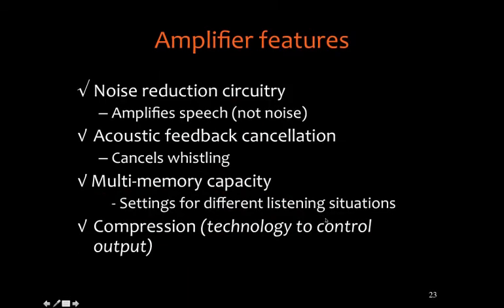In addition, digital processors have a better capacity now to provide what's called noise reduction. The overall intent here is to amplify speech but not background noise. And as you probably remember from your Basic Facts in Hearing Loss video series, the number one complaint of persons with hearing loss is the inability to understand speech, particularly in a background of noise.